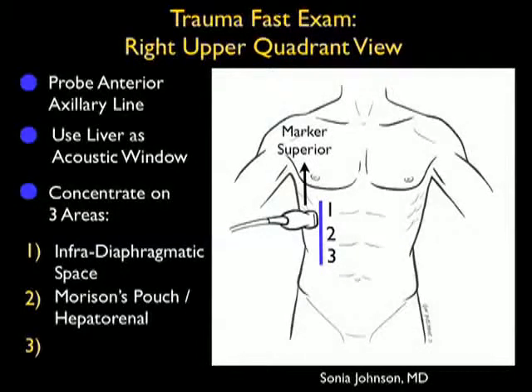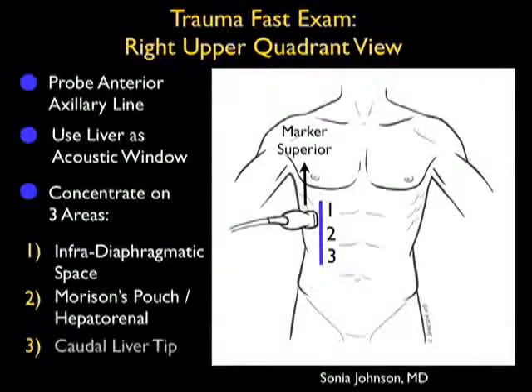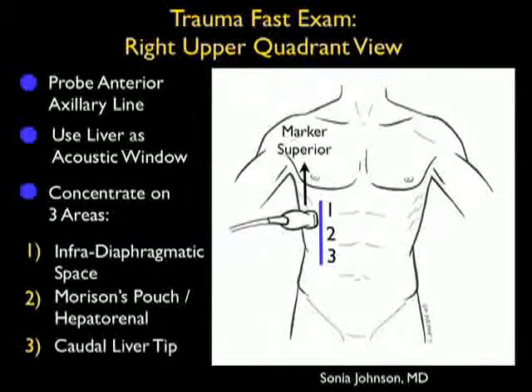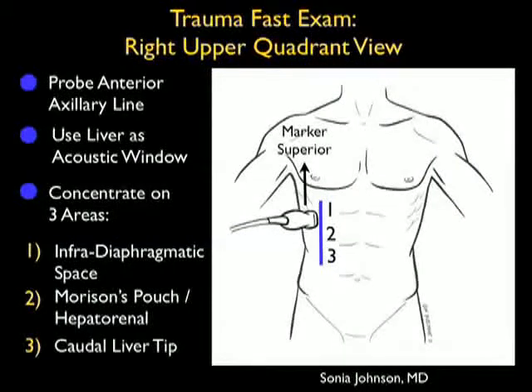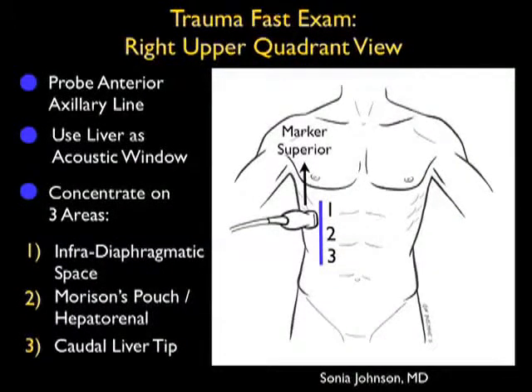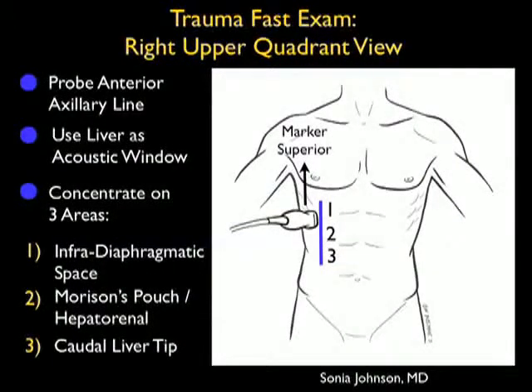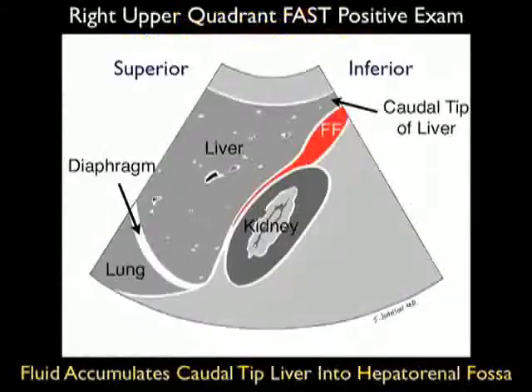Position 2 is the traditional Morrison's pouch or hepatorenal interface, and position 3, to round out the exam, is looking at the caudal liver tip representing the beginning of the right pericolic gutter.